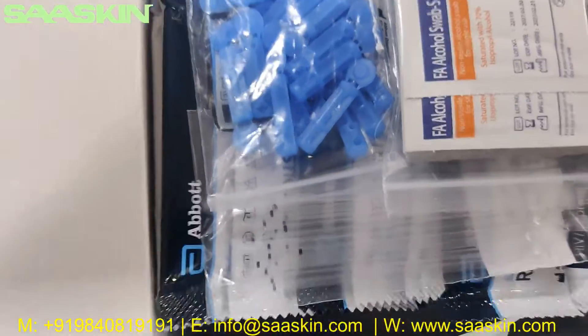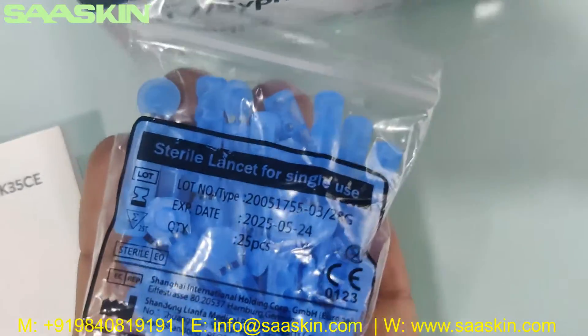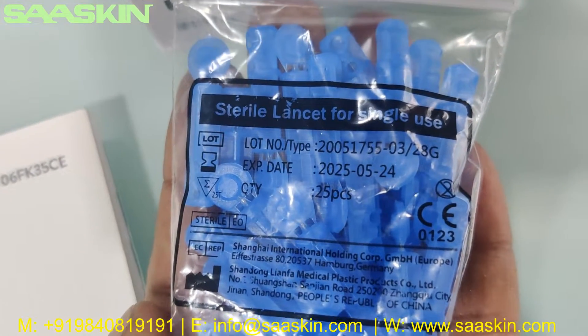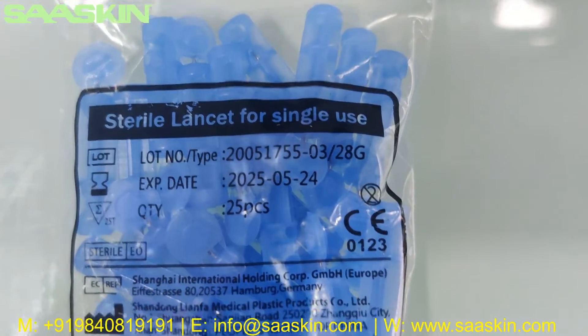Further inside, you get 25 pieces of lancets — sterile lancets for single use. You can see the manufacturing date, CE certification, and the lot number on the packaging. So you have 25 pieces of lancets here.